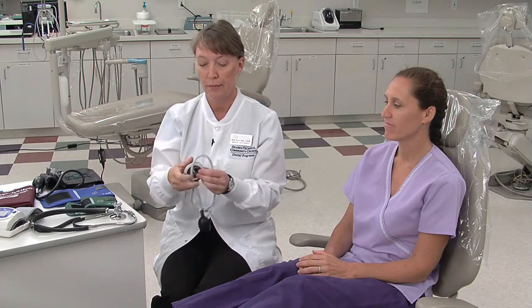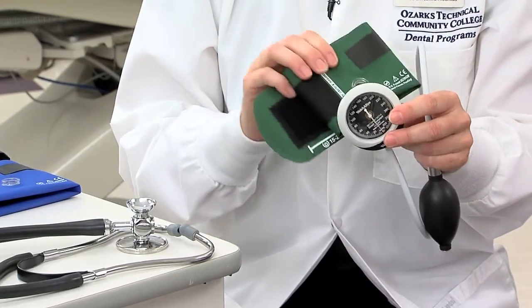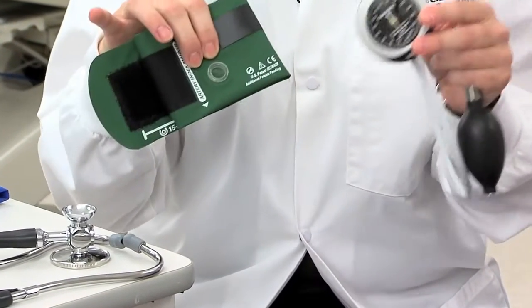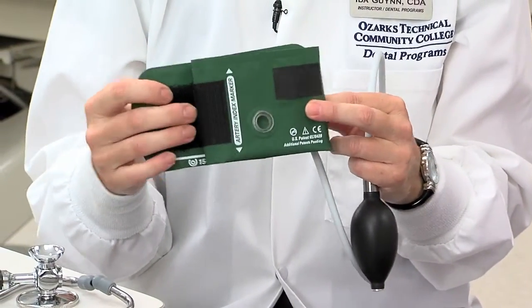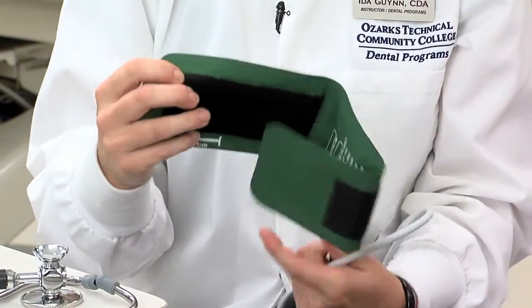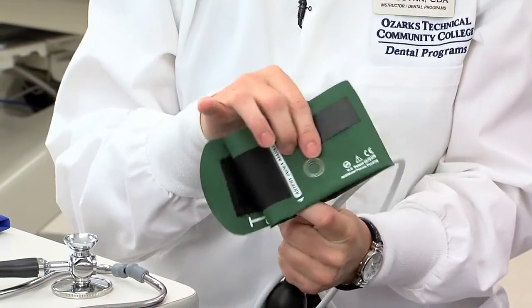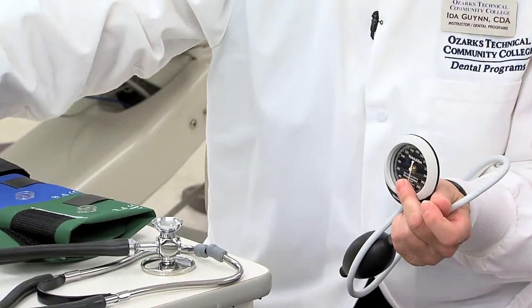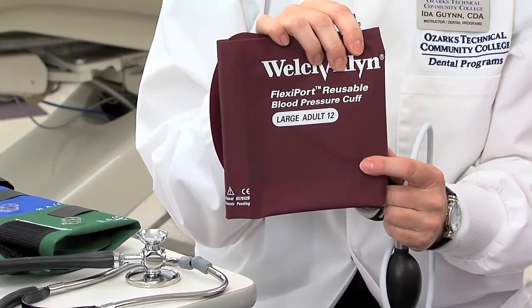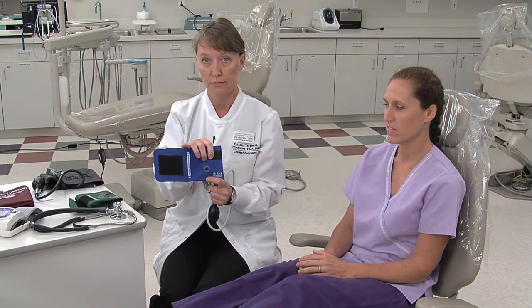The sphygmomanometer is actually the blood pressure cuff. This particular type of sphygmomanometer is flexible. It can be attached to different size cuffs. This one being a child size cuff. It can be attached to the port on this side. It also has a large adult cuff and a small adult cuff.